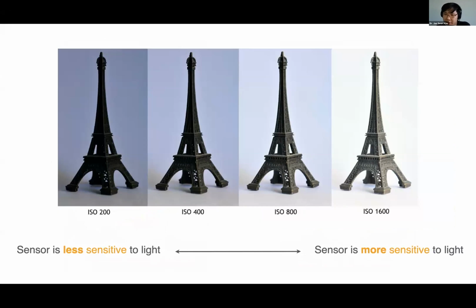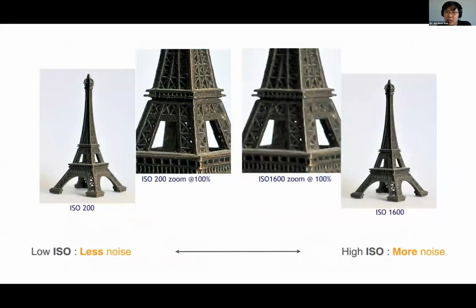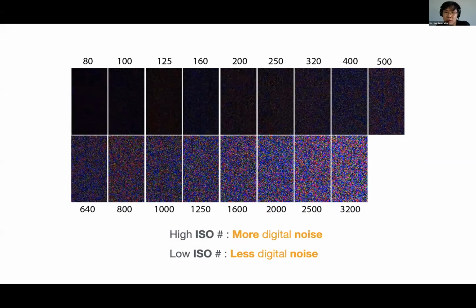So you might think, oh, we should shoot all our photos in high ISO. The problem is, as the ISO gets higher, you get more digital noise. The cameras have done a great job. Now you can go up to 1600 and 3200 ISO, and you can take pretty good photos, but in dental photography, because we take photos for documentation, you want to lower the ISO as much as possible so that you get a clear image, especially when you blow up the picture.